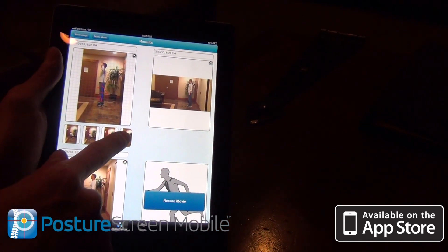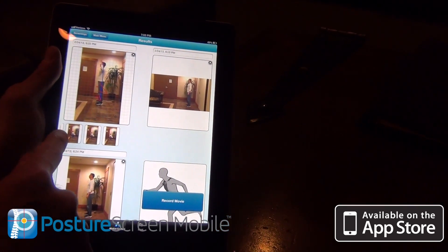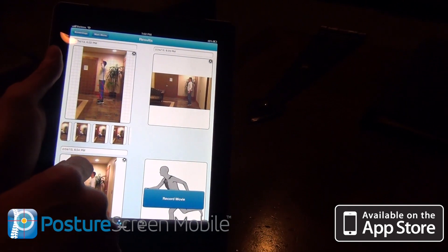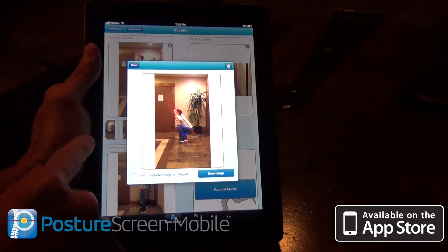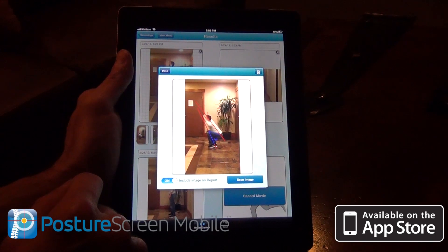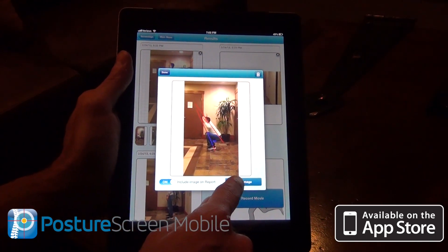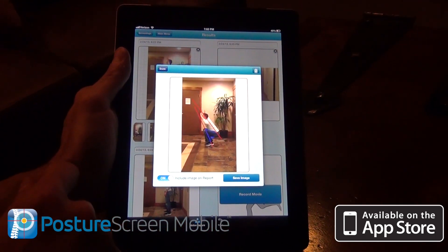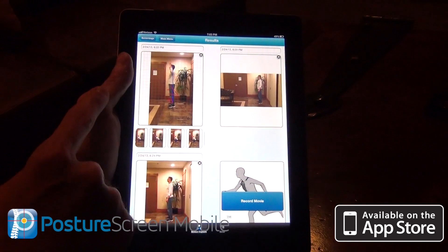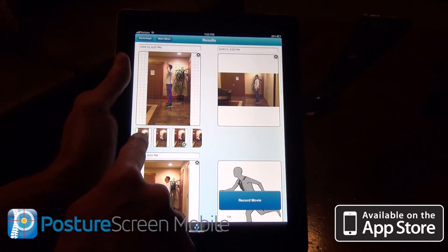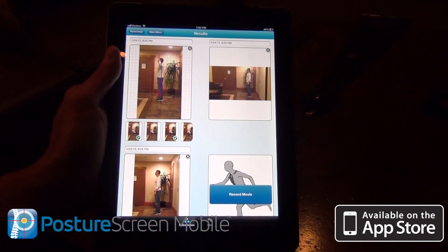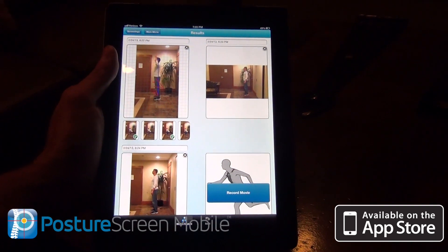The cool thing about this is all the snapshots are right here. If I want to add one to the report, I'm going to go ahead and turn that on. This button basically will save it to the camera roll. I'll hit done there and put the first one on there as well.